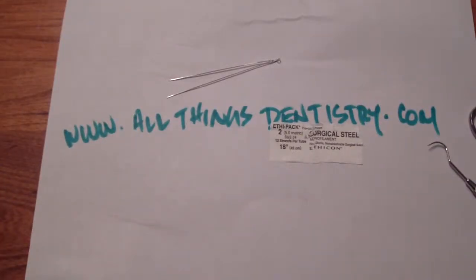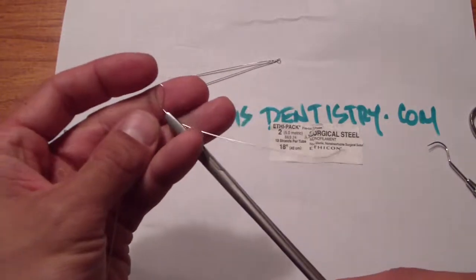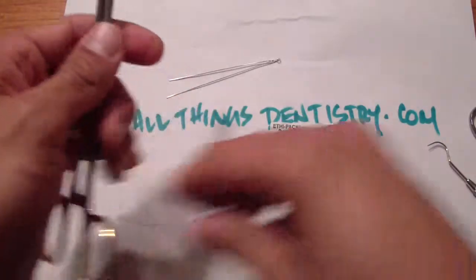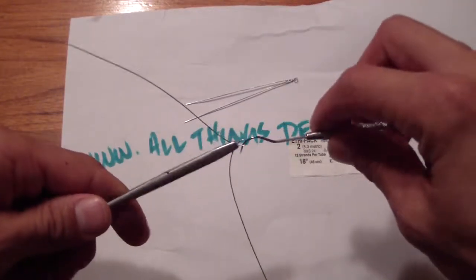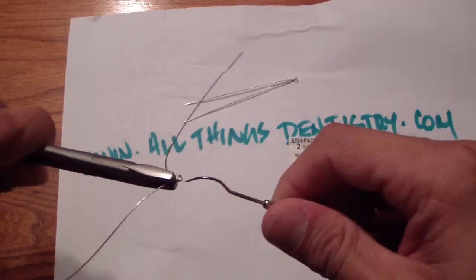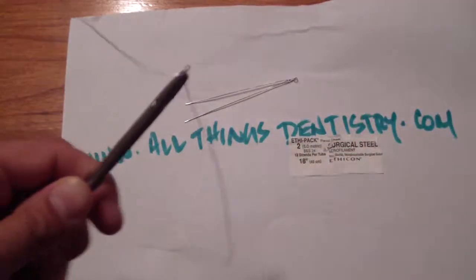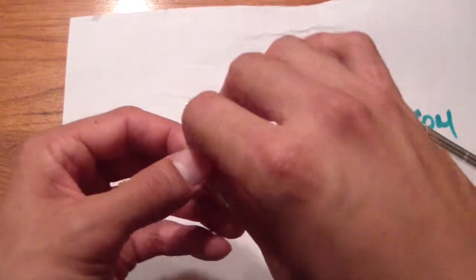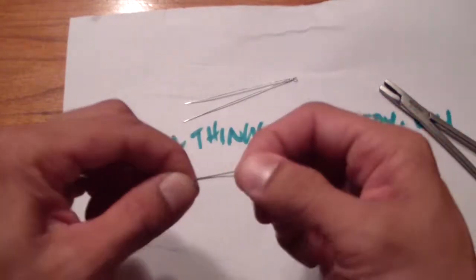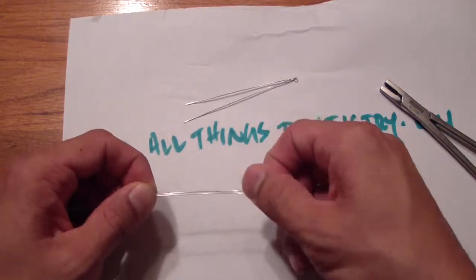Let's take our drivers — there we go — and just rotate one or the other. Remember, 24 gauge wire: if you use anything heavier you can't maneuver it, and if you use anything lighter it breaks. And there you go — that's it.